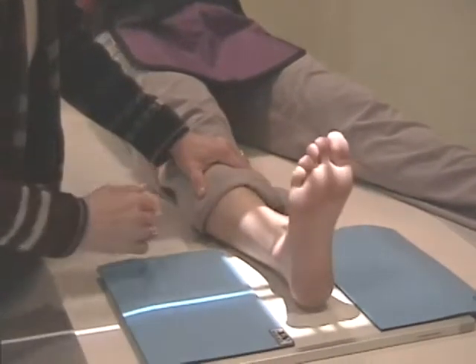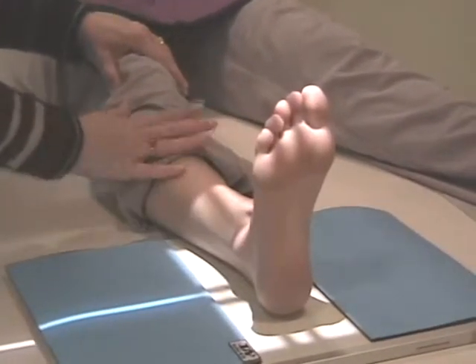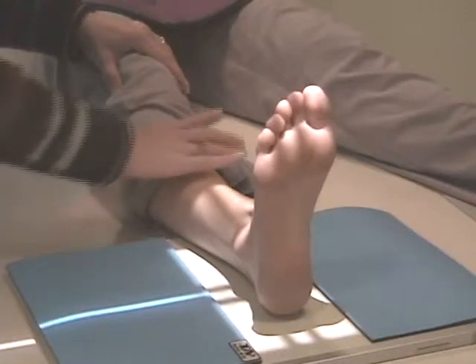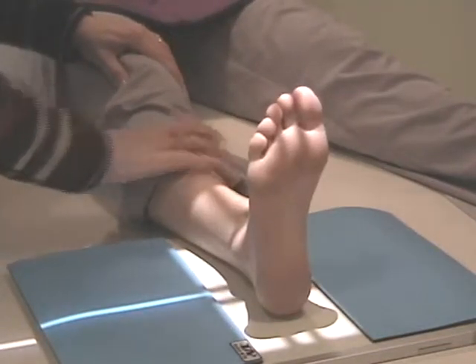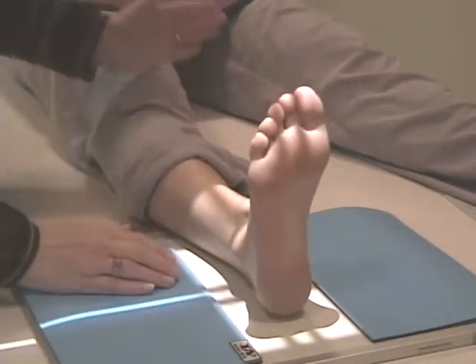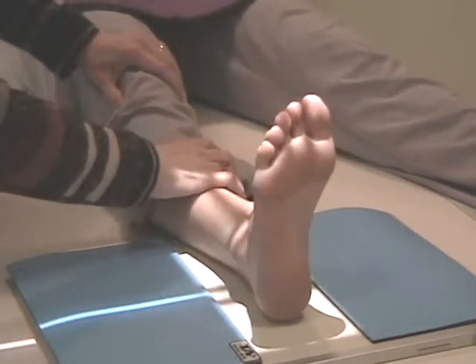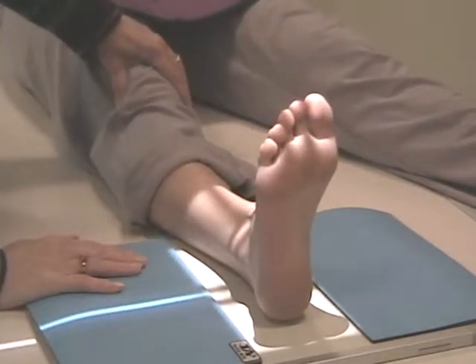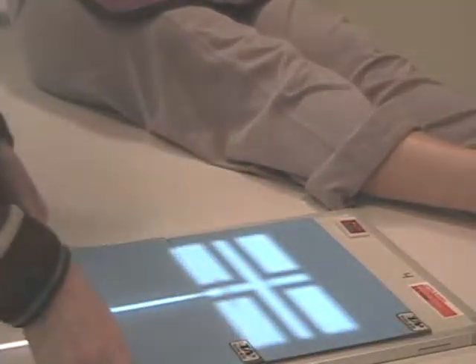And we want her foot flexed, and we want her toes straight up in the air. Leg coming off straight, foot straight up in the air. Not tipped one side or the other, but the leg coming up very straight. Can you scoot down just a little bit? There you go. Okay. And we can make our exposure. You can have your patient move their leg, and you move your lead strip.